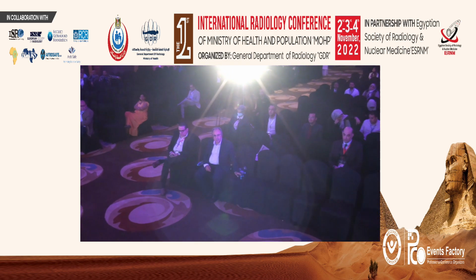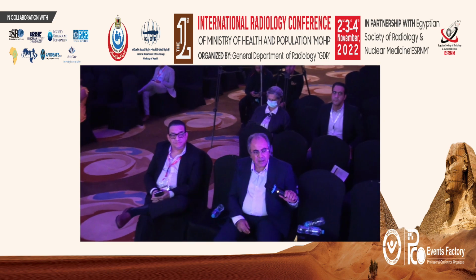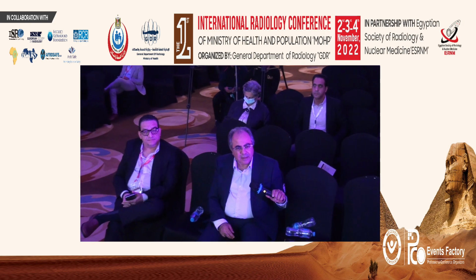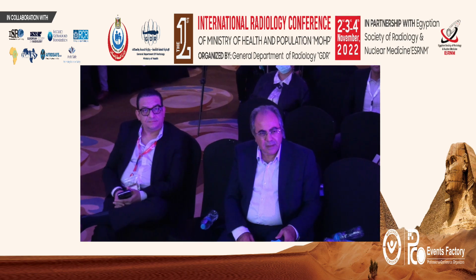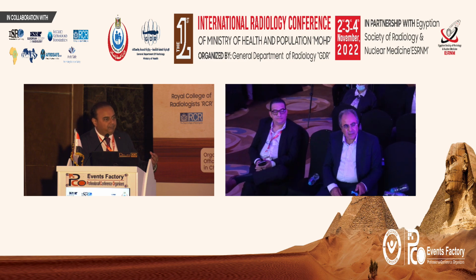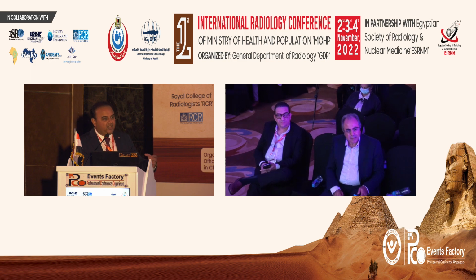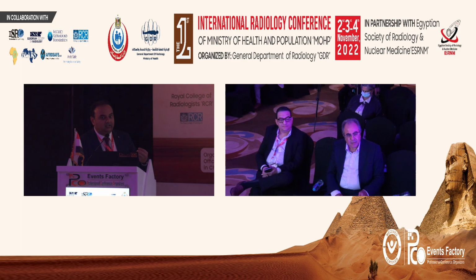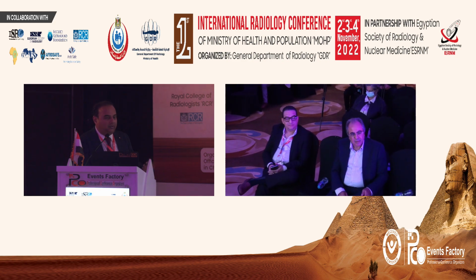Thank you. I'll just say from my perspective how, as an institution in London, in King's, we use IRE. We have a great relationship with our surgical team, and we use IRE very synchronously, both percutaneously and intraoperatively. If there is something that can be done percutaneously, we tend to do it percutaneously. But if you think it's a higher risk procedure, it carries higher problems, and needle placement is not possible percutaneously, then we tend to do intraoperatively. We work very closely with all our HPB surgeons.